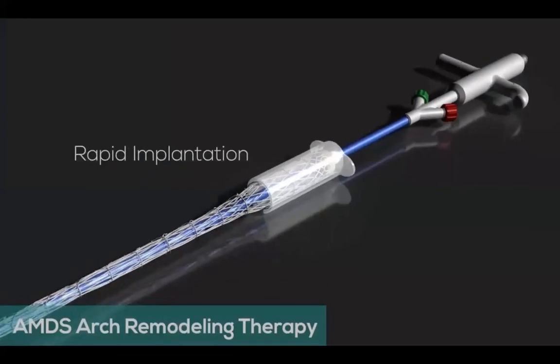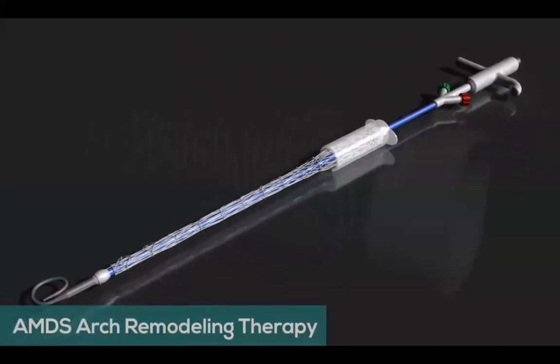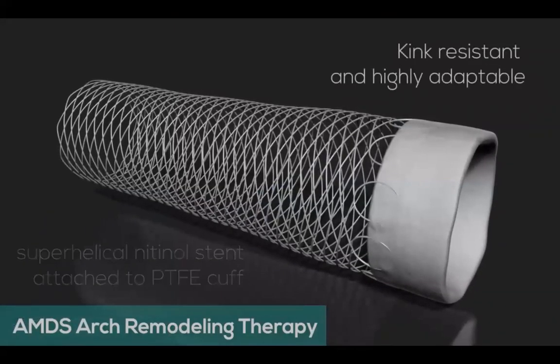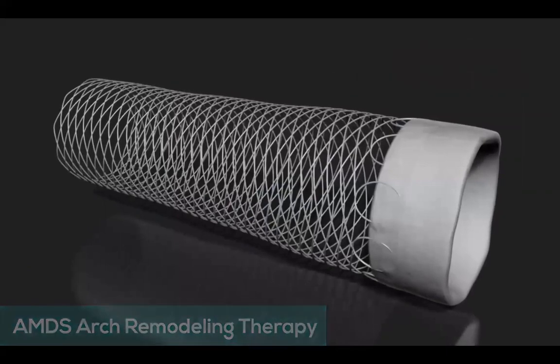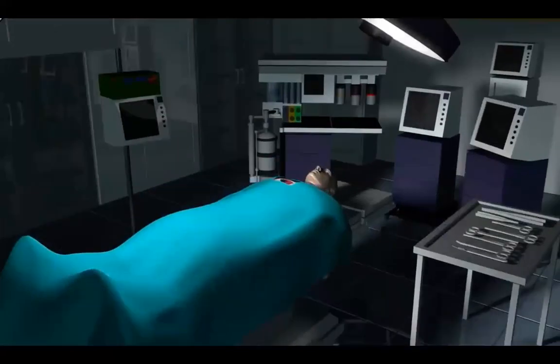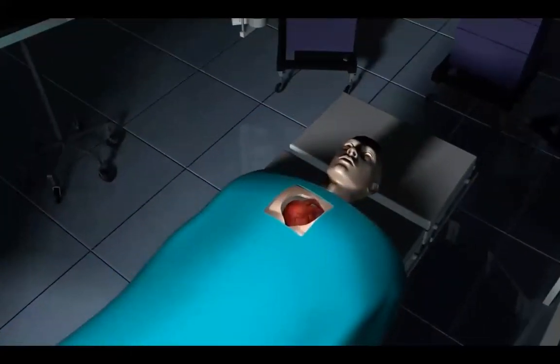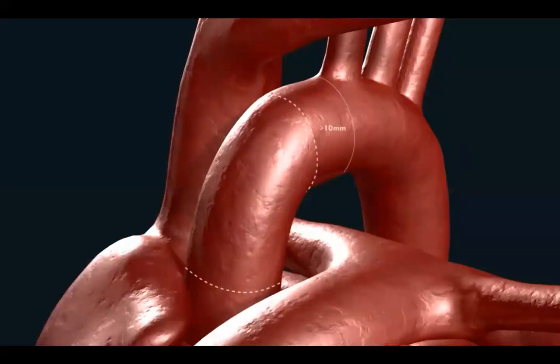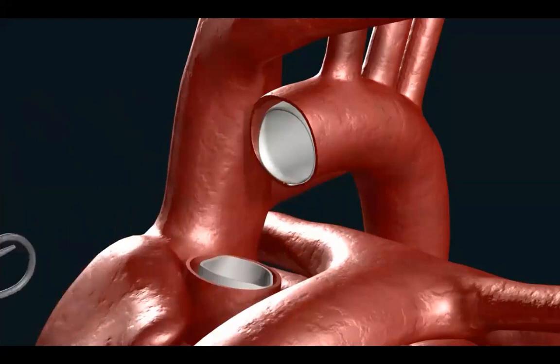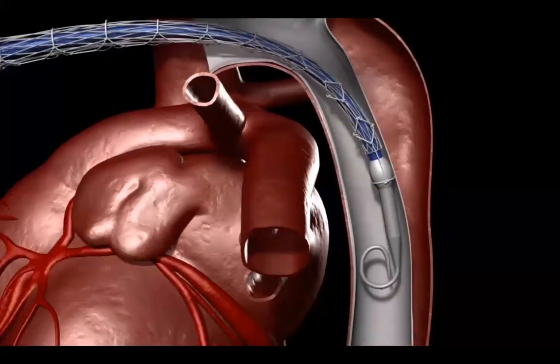And this is the device that comes on. It's very simple, easy to use. And like I said, you don't need a hybrid room. You don't need radiology. You don't need fluoro at all. You just size it beforehand, pick your size, it comes out of the package, and they hand it to you. And no wire. You can use a wire from below, but it's absolutely not necessary, and it's not recommended. So you do a slightly different incision. You advance the device, and it goes down quite easily. It's curved already.